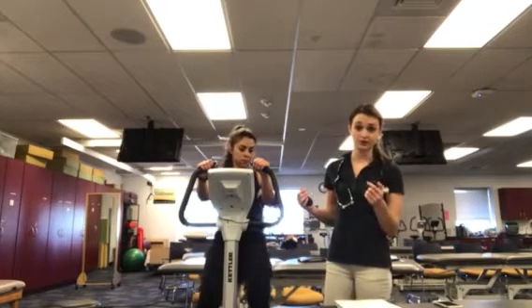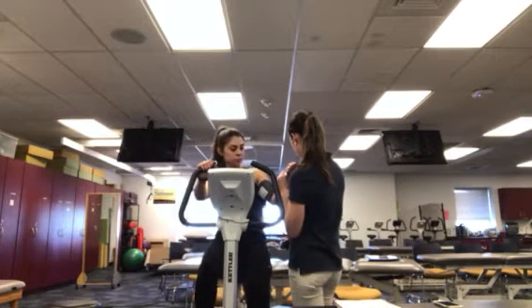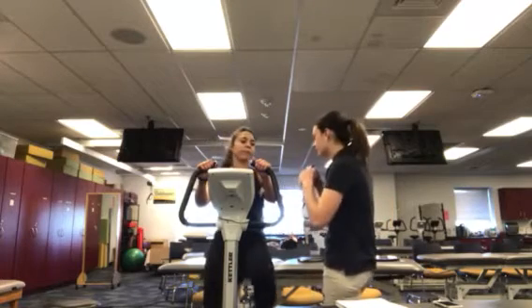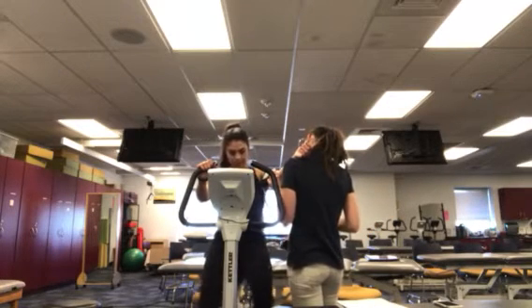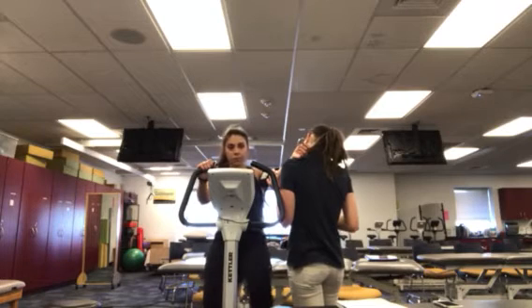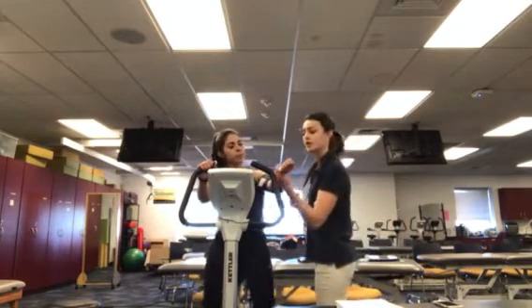Perfect, we're getting up to 2 minutes, so I'm going to take Brooke's first heart rate measurement. Perfect. Now I'm going to take her blood pressure. Go ahead and rest your arm on your shoulder for me, or on my shoulder. Nice and relaxed for me. Wonderful. And then one more heart rate measurement. Perfect, we're at that 3 minutes.